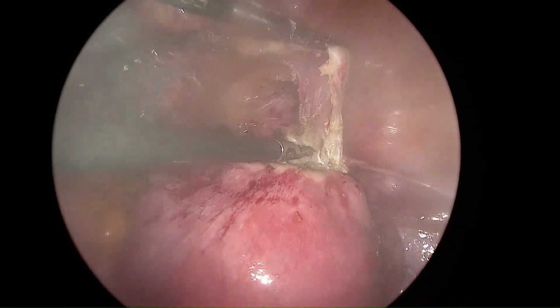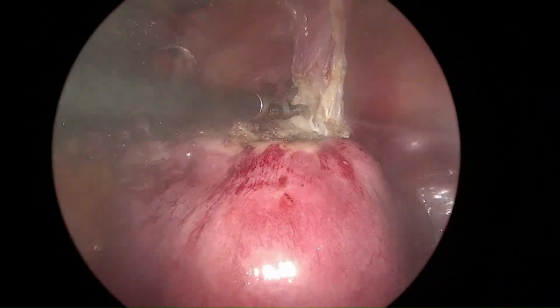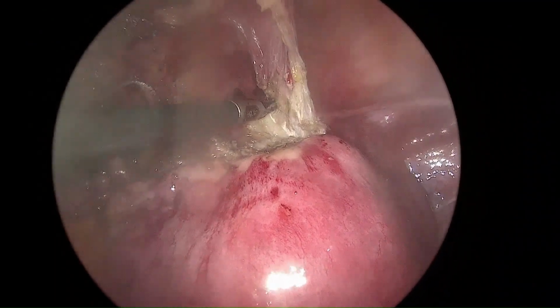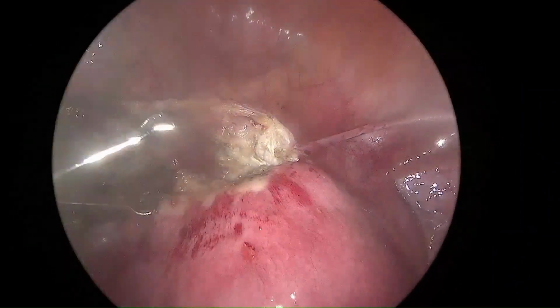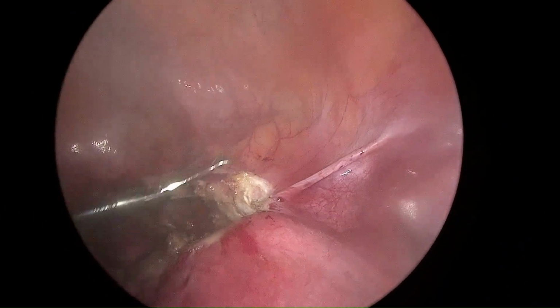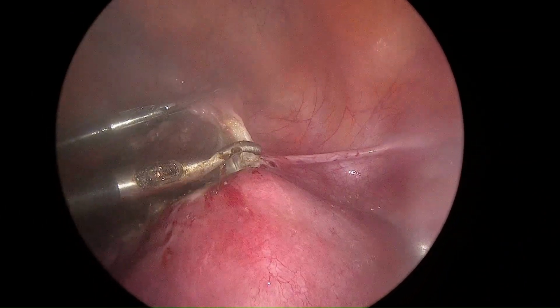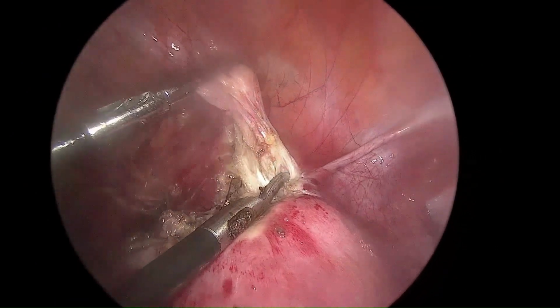So now the bladder is lifted and the scar is delineated separate from the uterine arteries, and a nick is given on the scar area slowly and steadily in order to see to it that none of the bladder fibers are cut while cutting the scar.